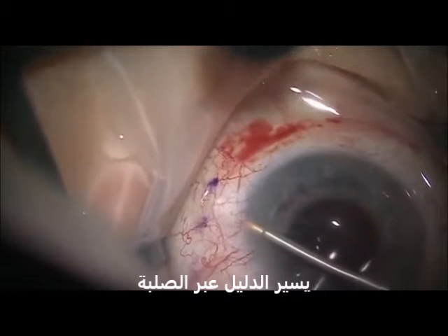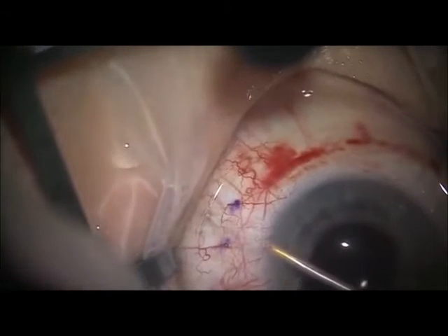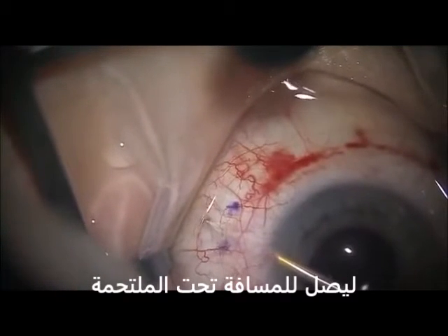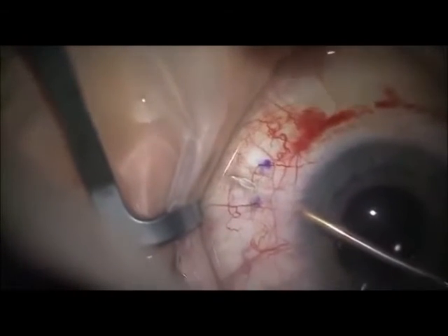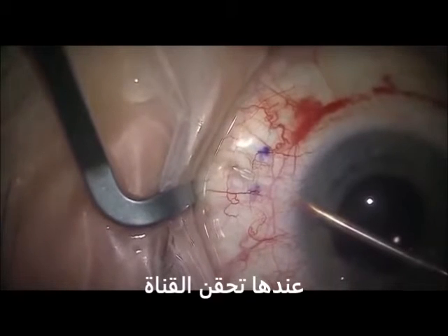The needle is inserted through the angle, creating a scleral tunnel. Markings 3 millimeters from the limbus were placed preoperatively on the conjunctiva to reference the exit of the needle from the sclera. When the needle exits the scleral tunnel, it should be within a half a millimeter, plus or minus, from the markings.